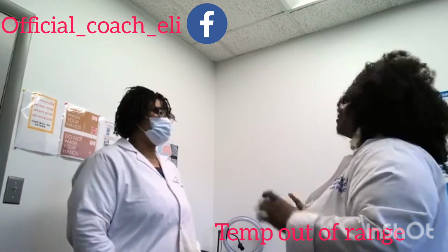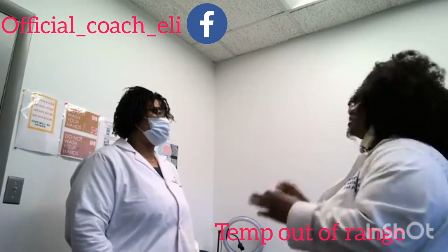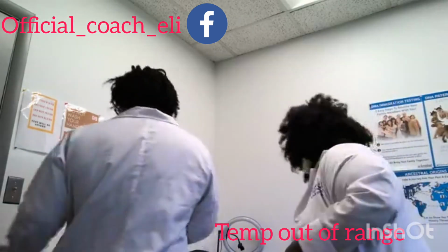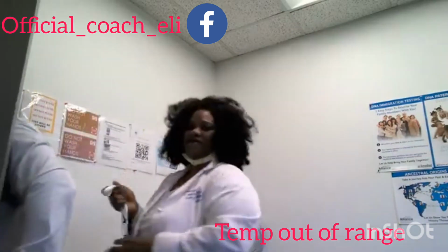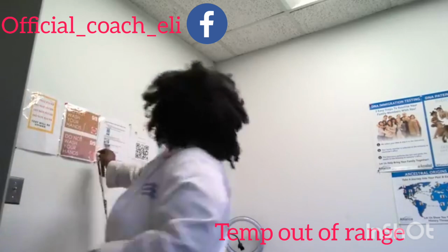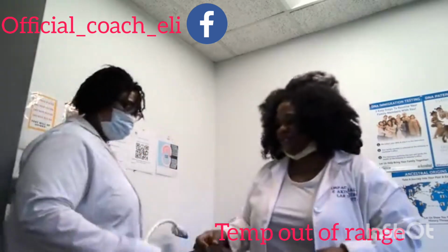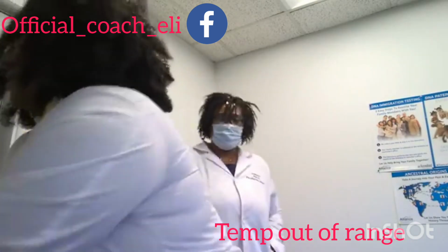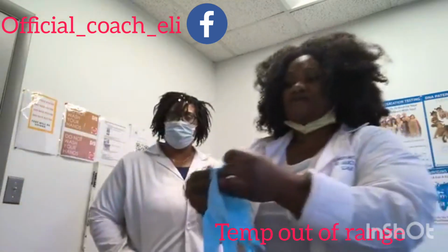After 4 minutes, if you come back after 4 minutes, your test is going to have to be voided, and you have to come back another day. Is that clear? Yes. All right. Thank you. So let's go. I'm going to go with her. All right. Come on back. So once that's done, I'm going to then put on my gloves right there. I'm going to have to put on my gloves.